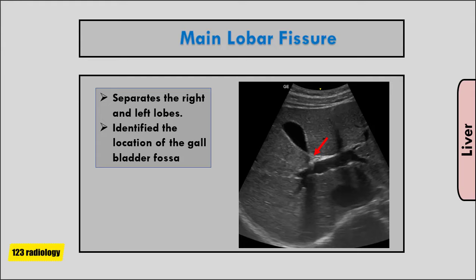If you have trouble finding the gallbladder, if you can find the main lobar fissure, it directs you to the gallbladder fossa.